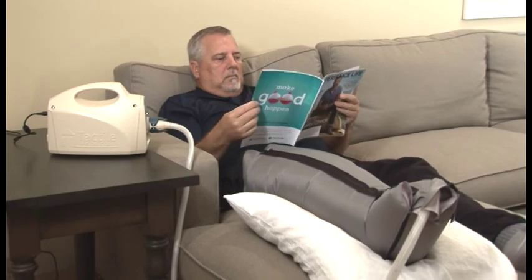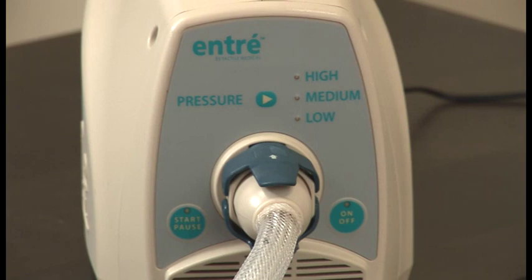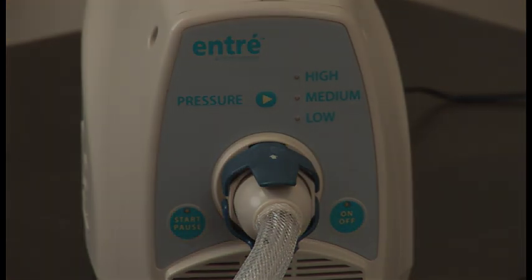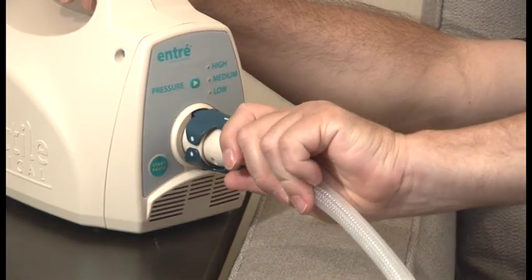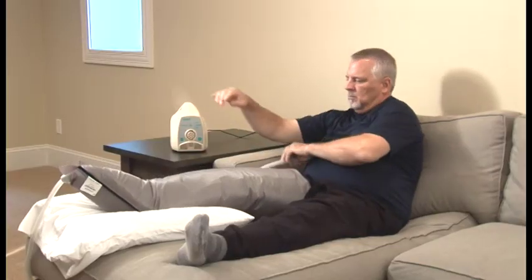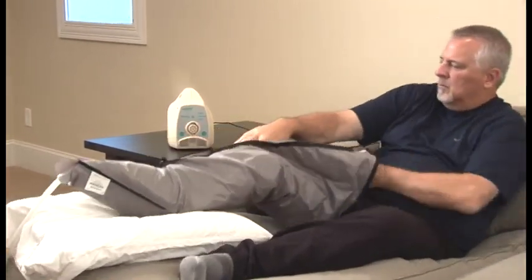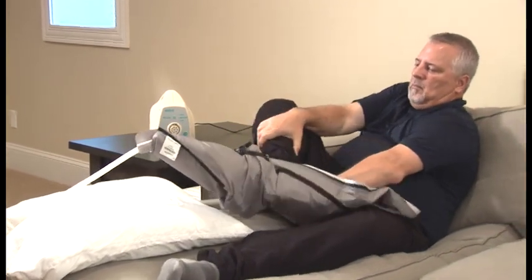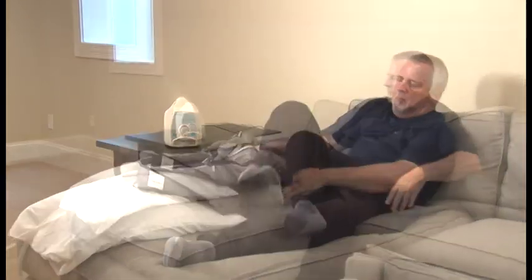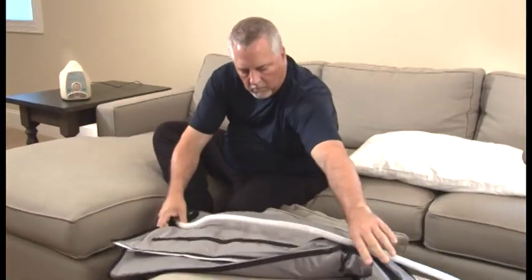When you've completed your therapy session, turn the controller off by pressing the On/Off button on the front panel. Your therapy session is now complete. To disconnect your garment from the controller, gently squeeze the tabs on the back of the latch and pull it away from the controller. If convenient, you may keep your garments connected to your controller between therapy sessions, or remove and store them for your next session. We recommend storing your device and garments in a location that is convenient to access for your prescribed therapy.